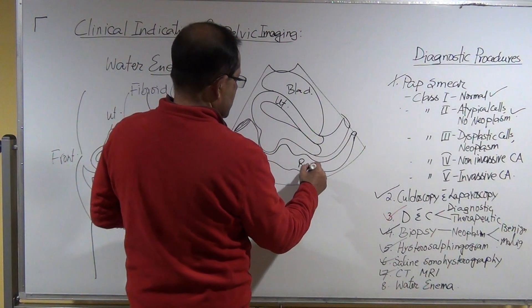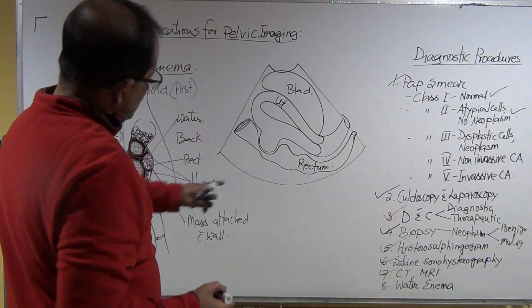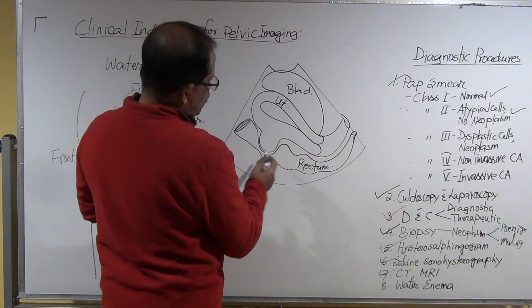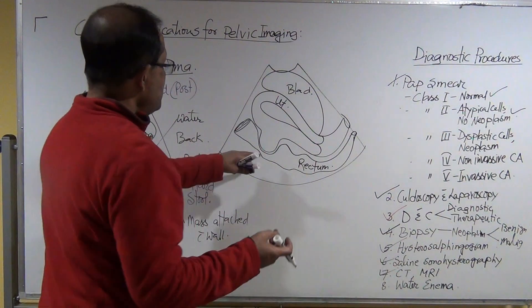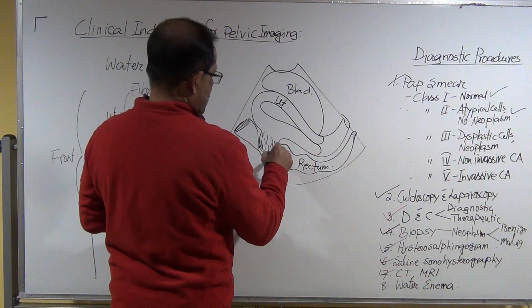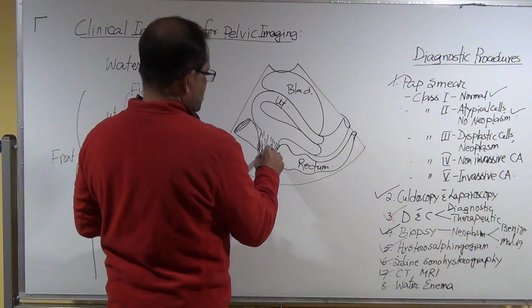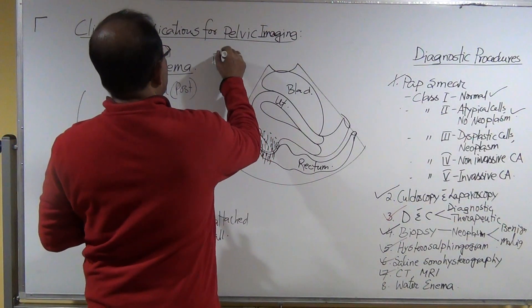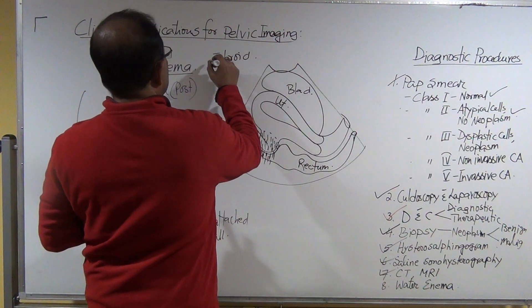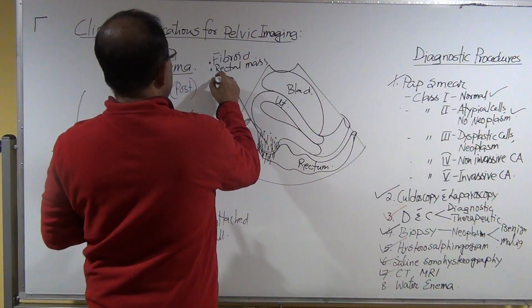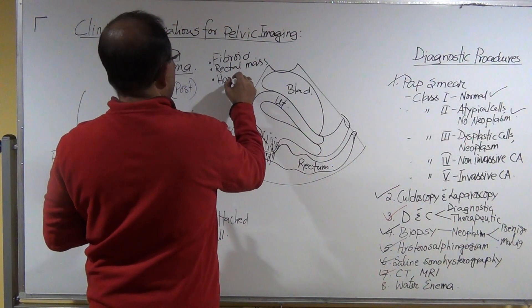Okay, this is the rectum. Look here — how the rectum is compressed. Sonographically, you cannot rule out whether this mass is within the rectum or not, whether this mass is a fecal mass or not, because it gives a posterior shadow and looks heterogeneous and complex. So it could be a fibroid, it could be a rectal mass, and it could be hard feces.